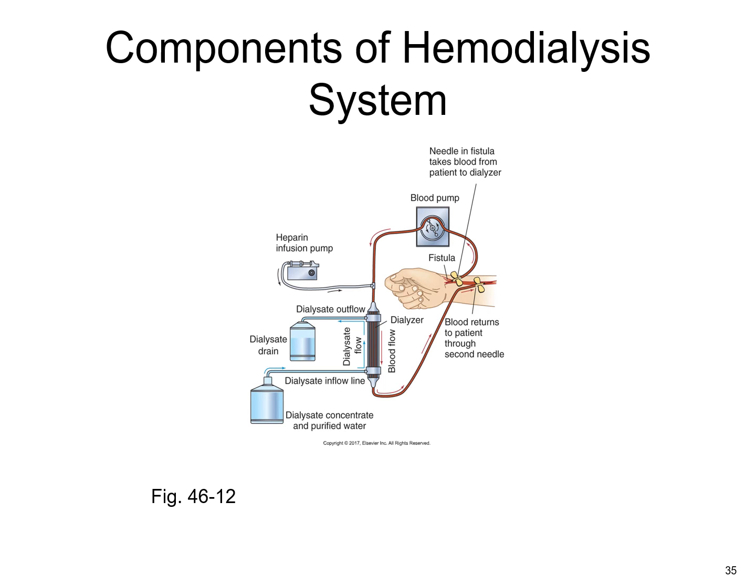So this is what components of a hemodialysis system may look like. You could follow it basically. So this is from the patient going to the dialyzer. Then you would get your machine, the fake kidney. People might call it an artificial kidney; that's the other word they may use.